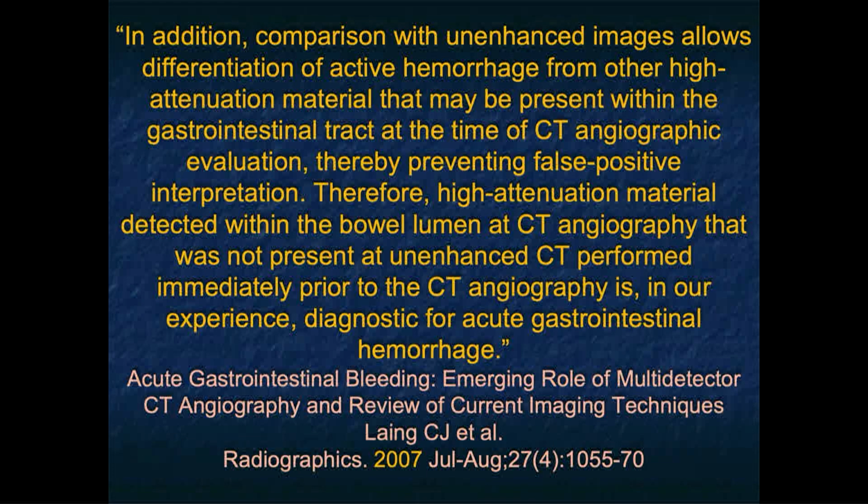One of the things, again, in terms of protocols, and I showed this article just to make the point again, this is 2007, which is like a lifetime ago. I forgot who was president then. But 16 years ago, the recommendation was doing non-contrast scans, which I mentioned we're not doing now.